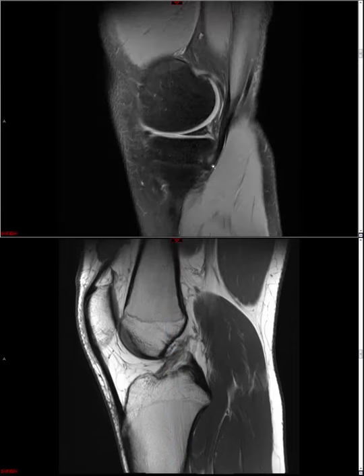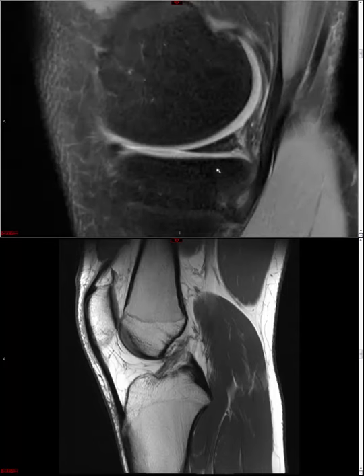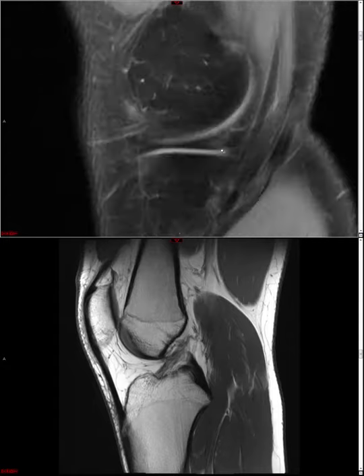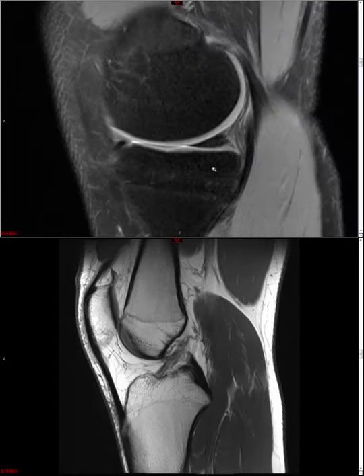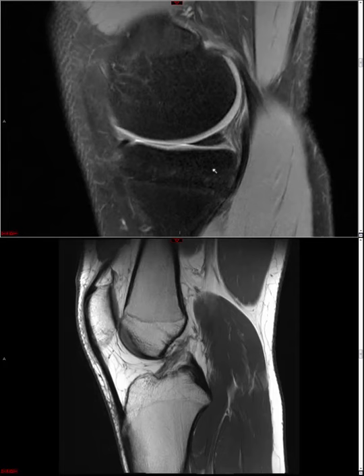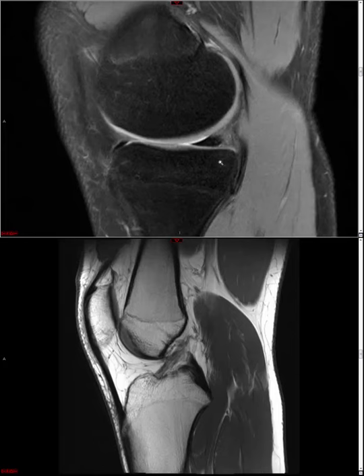We diagnose a meniscal tear if one of two criteria are met. Either we see linear surfacing signal extending to either articular surface on any two images in the study corresponding to that same location, or we see abnormal morphology of the meniscus on any one image anywhere in the study, provided that there's been no prior surgery, and the postoperative meniscus will be beyond the scope of this discussion.